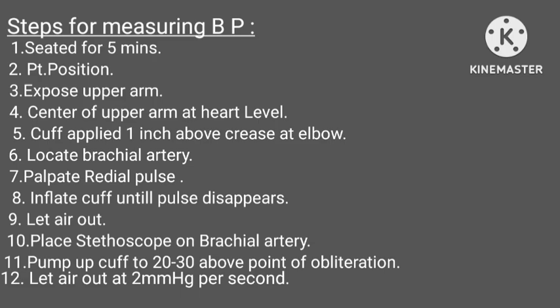let the air out, then place the stethoscope on the brachial artery, then pump up the cuff to 20 to 30 above the point of obliteration, and lastly let the air out at 2 mmHg per second.